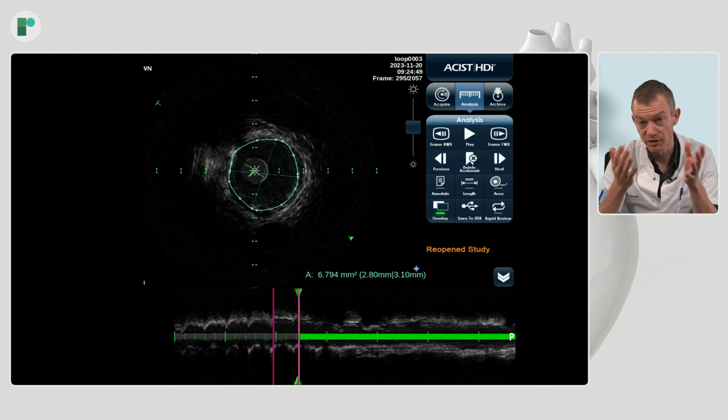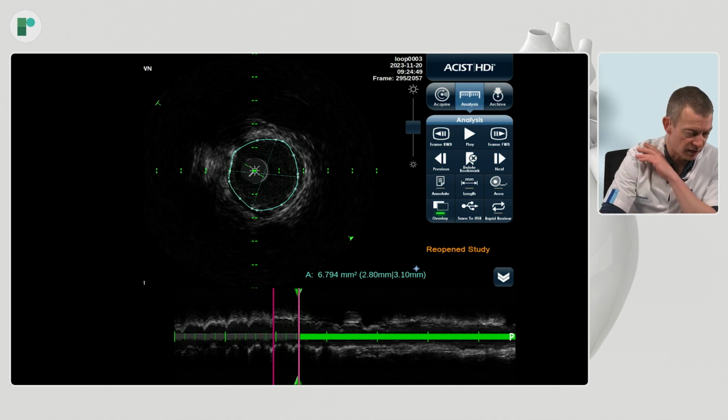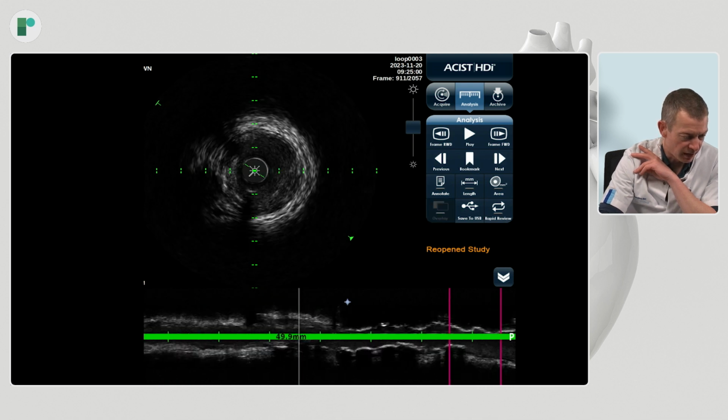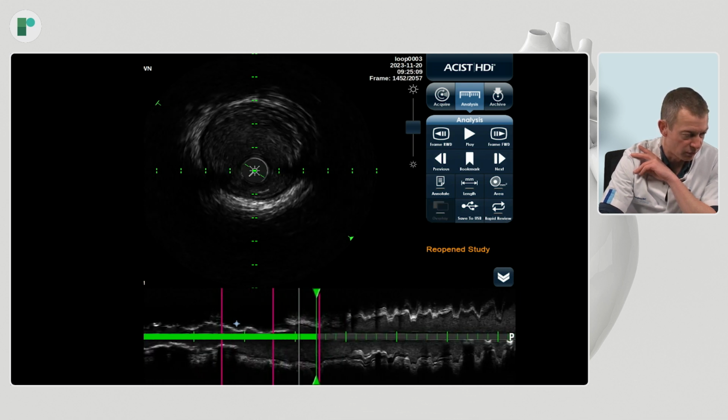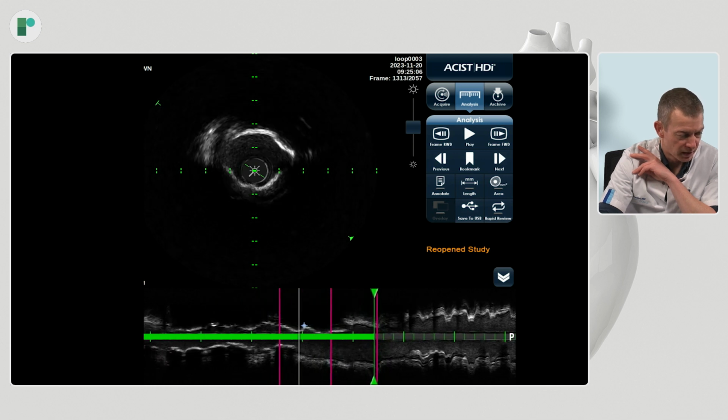With these stents, you always have the ability to post-dilate with high pressure non-compliant balloons. You can even upscale 0.5 millimeters or even a millimeter if you like. So with a 3.0 by 48 Onyx, we thought we could do the trick in this case. And then post-dilate proximally with a 3.5 NC balloon to high pressures here in the proximal part.